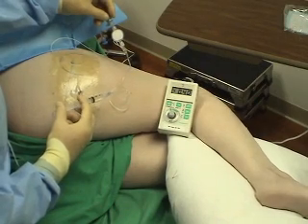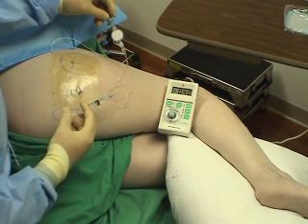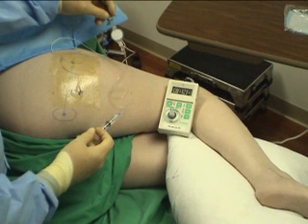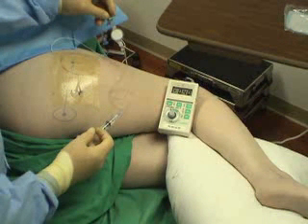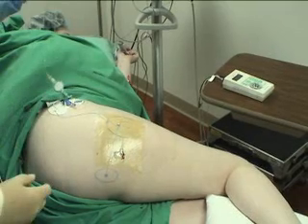The snap lock is attached to the catheter and the nerve stimulator to the snap lock. The nerve stimulator output is turned up until brisk muscle twitches can just be seen. Immediately upon injection of the local anesthetic agent, the twitches will disappear. This constitutes a positive Raj test, which gives final confirmation that the secondary block will be successful. The catheter and snap lock are placed in the stab lock, which is placed in a convenient position on the patient's hip or abdomen. The catheter exit sites are covered with a transparent dressing to allow daily inspection.